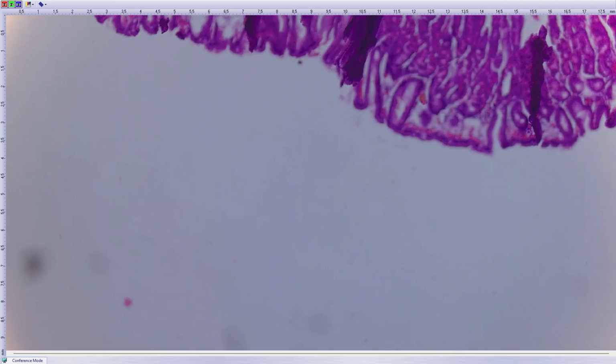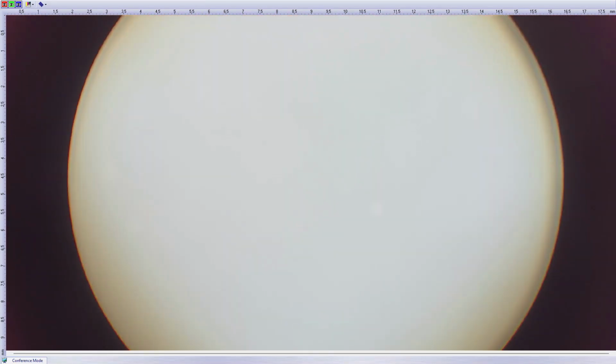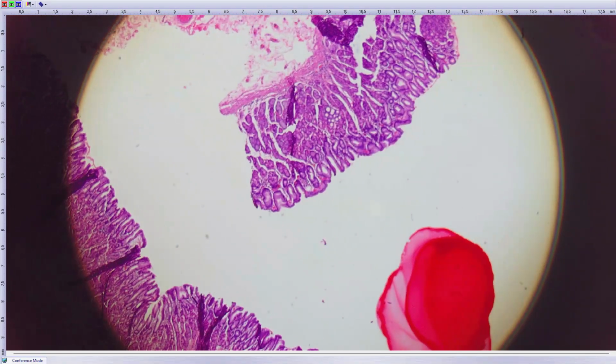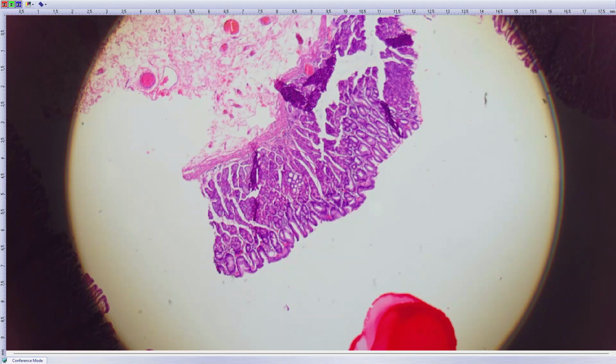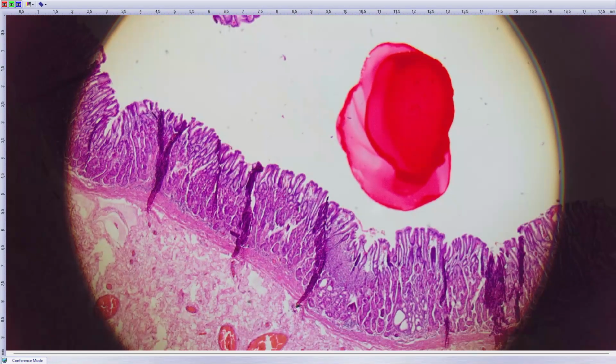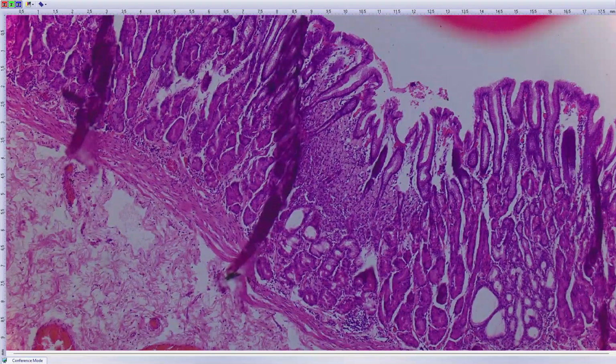Where did they do the genetic? I don't know. Where was all the genetics? I don't know. Moreover, the patient is diagnosed with BRCA mutation, so she is at risk for some other lesions. So I had to be very, very careful with reviewing all the slides.